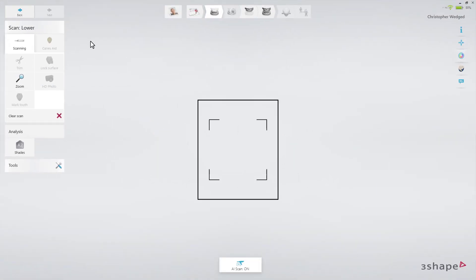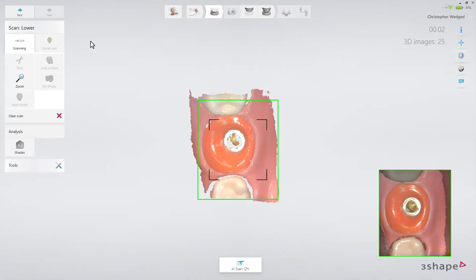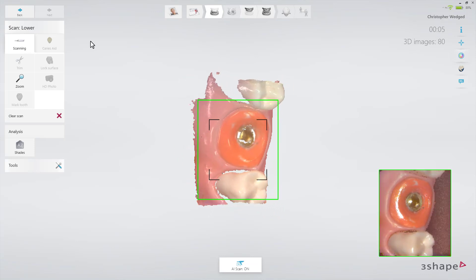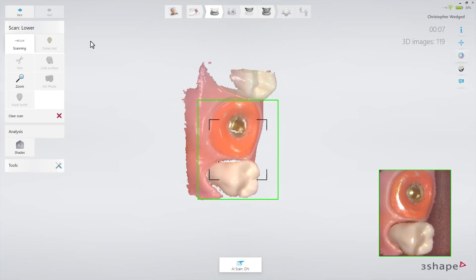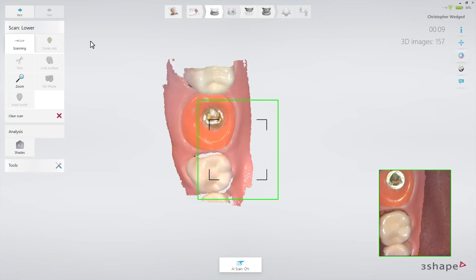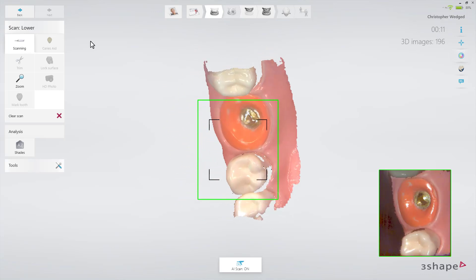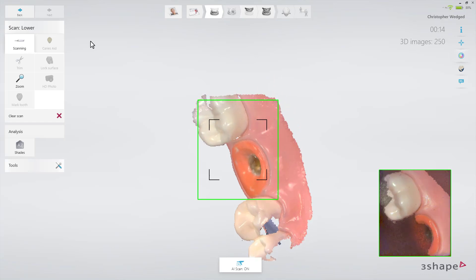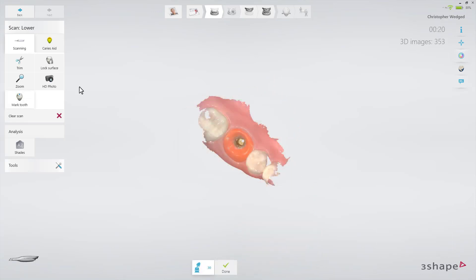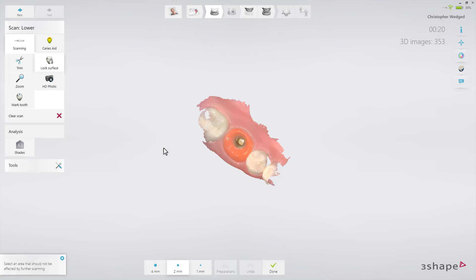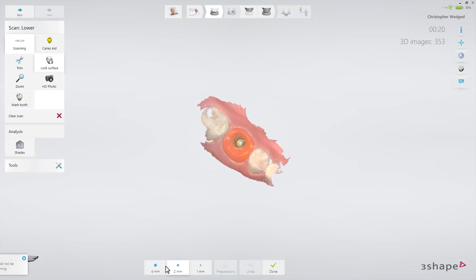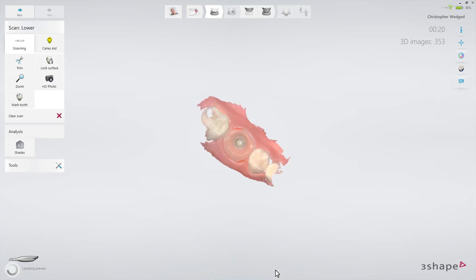There are two options to scan the arch with the implant. The first option is to remove the healing cap, dry the area, and scan the Emergence Profile immediately before the gingiva collapses. Make sure to get the entire area covered well. Then paint the area of the Emergence Profile using the Lock tool. This will freeze the Emergence Profile in its current retracted state, thus preventing it from being updated with later data when the gingiva might have collapsed.